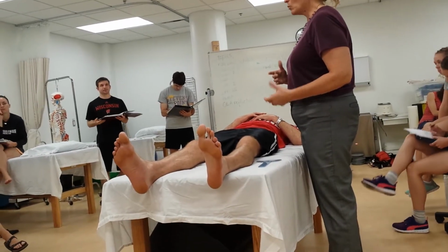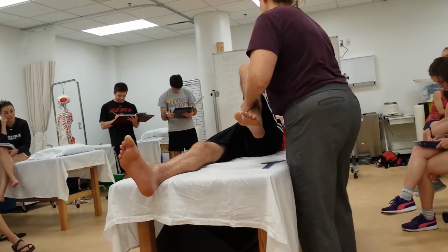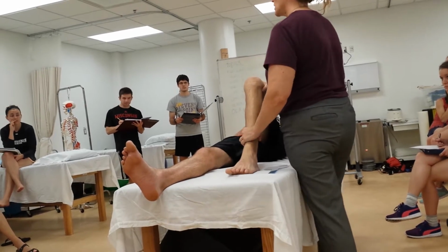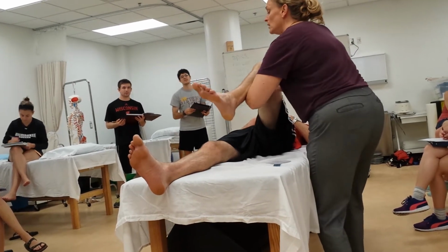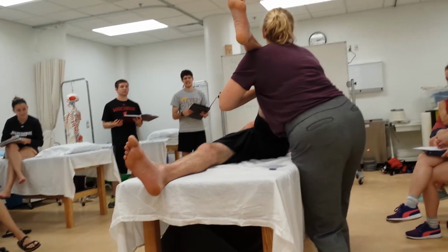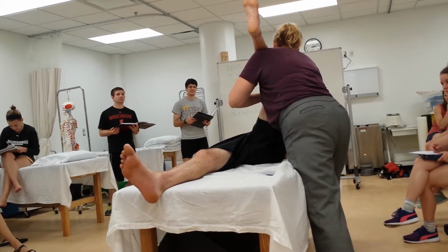Okay? Now, what you don't want to do is get in the habit of, go ahead and show it for me, there you go, pushing down like this, because you're going to be putting too much pressure on the knee in that position. Okay? So what you're going to want to do, for big, long legs, is go like this. I can say that I have a pair of my own. And I'm going to bring him forward.